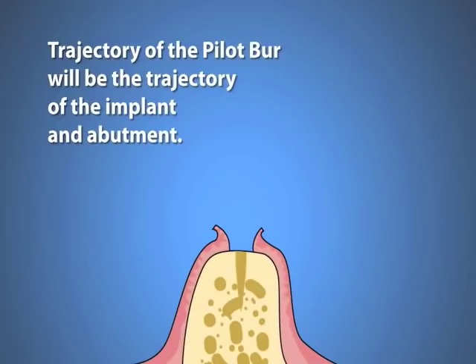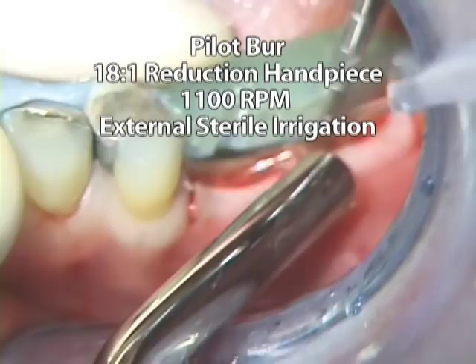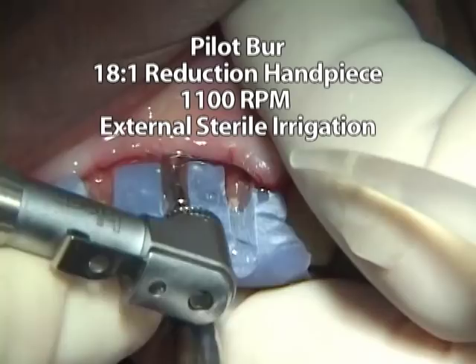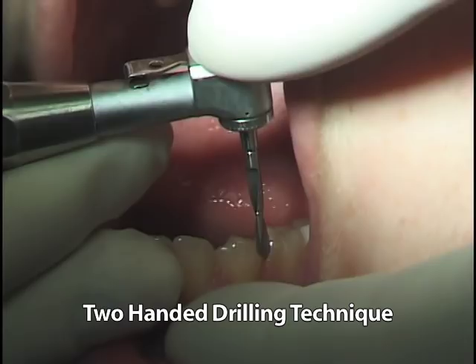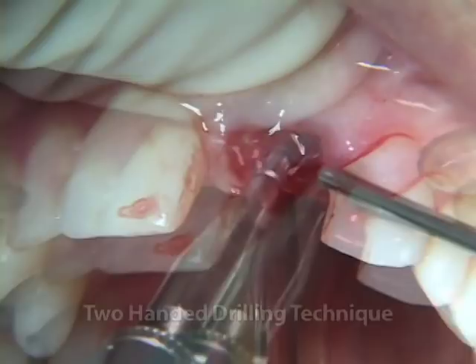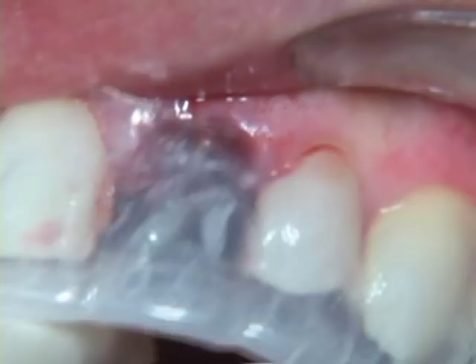Using a surgical template as a guide with a 2mm pilot drill in an 18-to-1 reduction handpiece, the initial penetration for the pilot osteotomy is made completely through the crestal cortex with the drill rotating at approximately 1100 RPM with external sterile irrigation. It is advisable to use a two-handed drilling technique, where one hand guides the drill while the other hand applies the apical drilling pressure. After half of the necessary depth of the osteotomy is achieved, the pilot drill is removed and a paralleling pin is placed into the newly formed osteotomy to assess the positioning and trajectory of the preliminary pilot osteotomy. A vacuum-form template is placed over the paralleling pin to confirm the appropriateness of the preliminary osteotomy while it is still possible to change its trajectory.